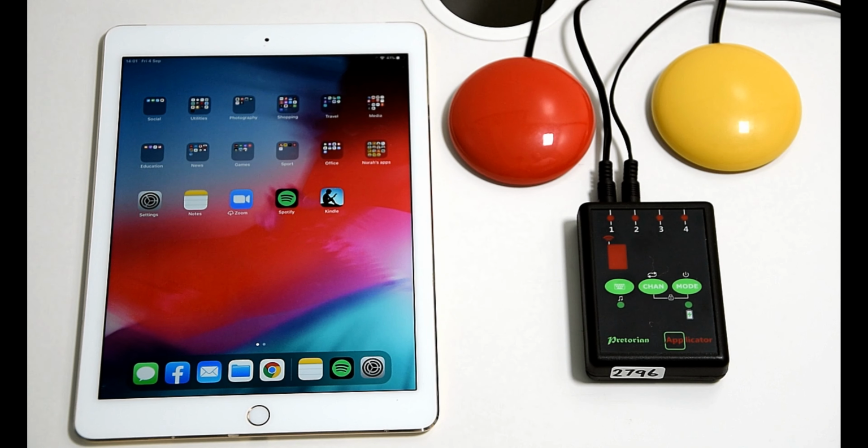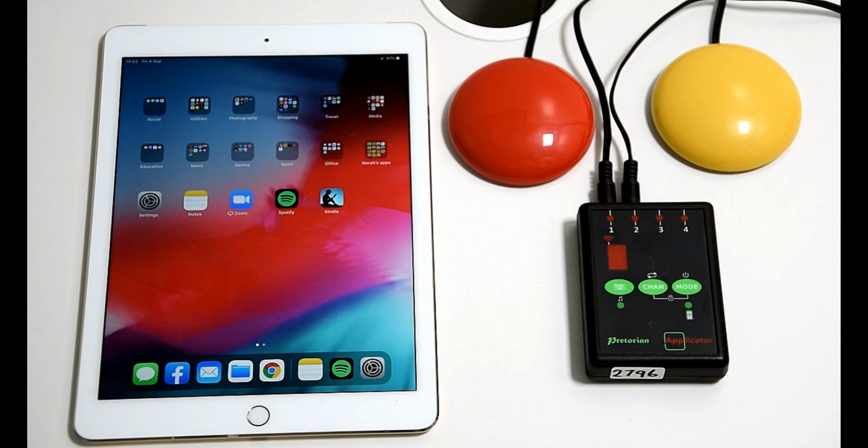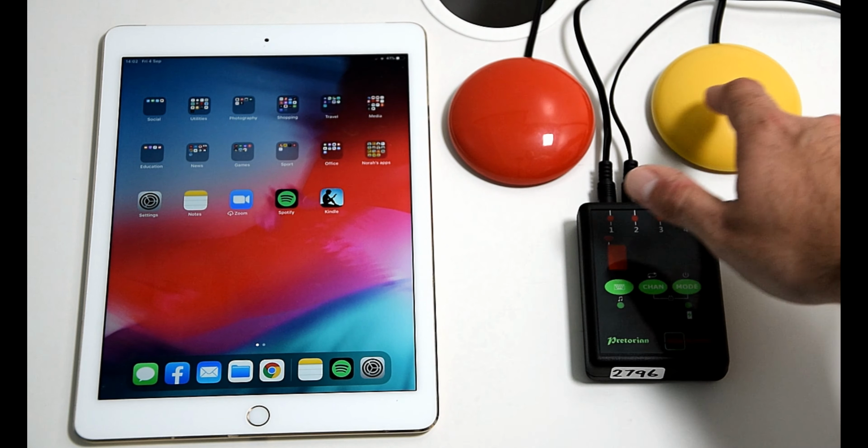The other really quick addition that I can show you with this device is the pop-up keyboard button. So what we found is that some apps would recognise the applicator as a keyboard, therefore you go into the app and the keyboard wouldn't appear straight away in the traditional sense. So we added it as a button on here to override that, so that if the keyboard for whatever reason in whatever app you require doesn't pop up, you simply just need to press the keyboard button. And it's this one here that we just used to hold down for the QuickMedia access. You just press it once for this, and I'll demonstrate that now.